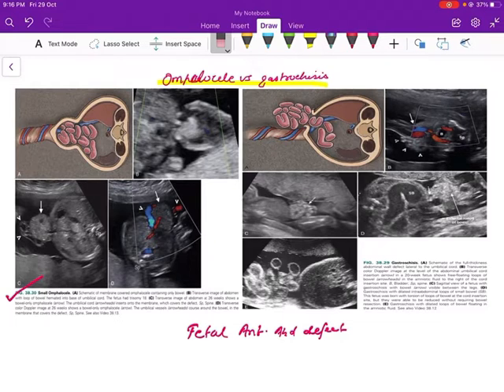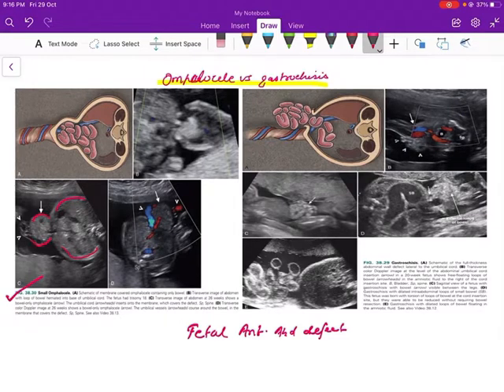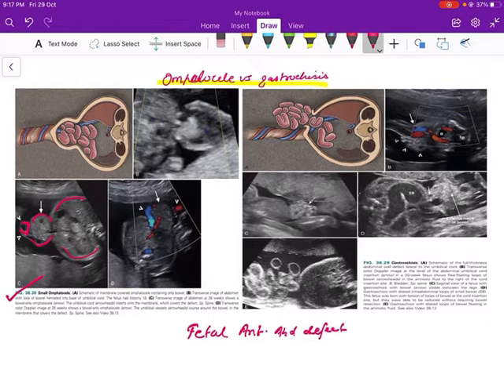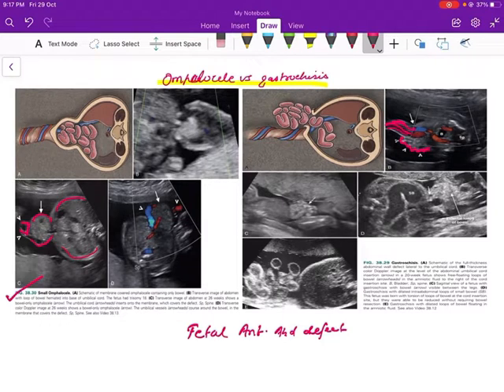Let's look at the ultrasound pictures. In this picture, this is the fetal abdomen and this is the herniated contents getting herniated from a midline defect, and the umbilical cord is seen inserting in the membrane at the apex of this herniated mass. In the case of gastroschisis, this is the site of insertion of the umbilical cord, and we see a mass herniating here in the right para-umbilical region, with small bowel loops getting herniated through the defect.